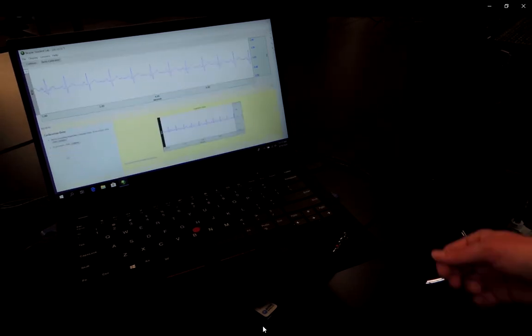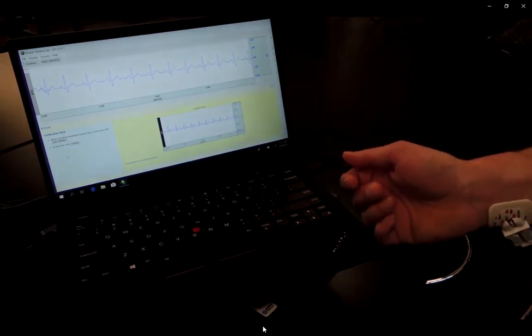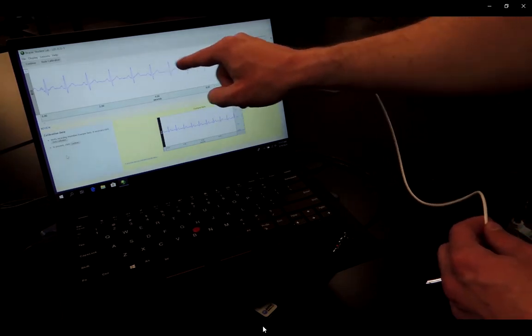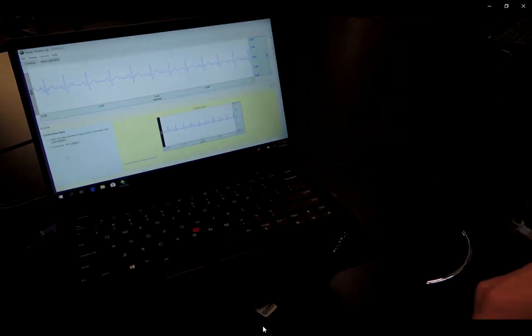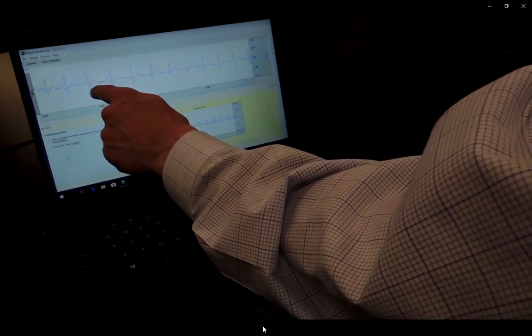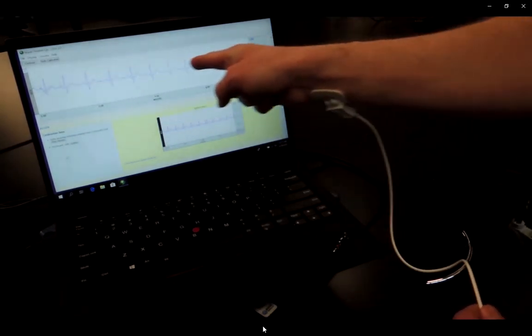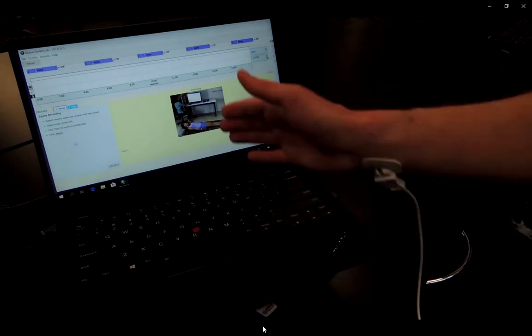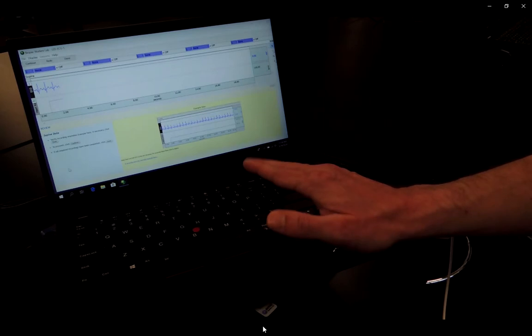during that calibration process. We have to sit real still because any movement of our electrical lead set is going to give us a lot of artifact, or a lot of bouncing of that line, instead of the clean shapes that we see here. And if you'll recall, we have a nice waveform here with a P, Q, R, S, and T complex. So our data looks good. This is our example data, and this is the data from our participant. We'll click continue.